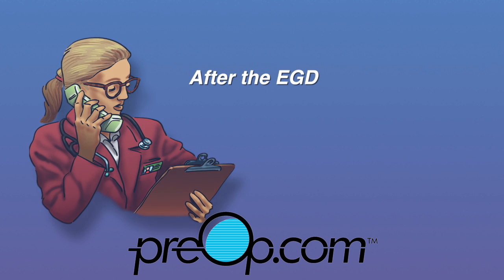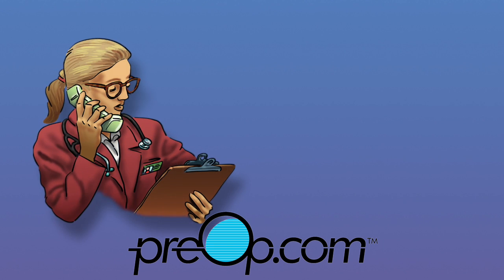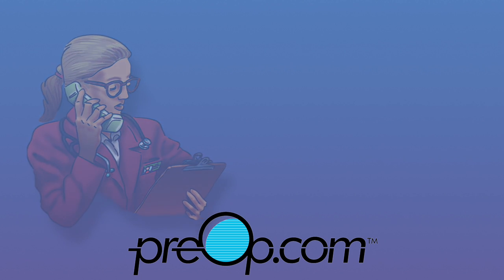After the EGD, your throat may be numb. You may have a sore throat, some gas pains, and cramping for a few days. Follow instructions about when you may begin eating and drinking after your procedure. It can be safe for some patients to start soon after. However, others may be advised to wait for a specific period of time.